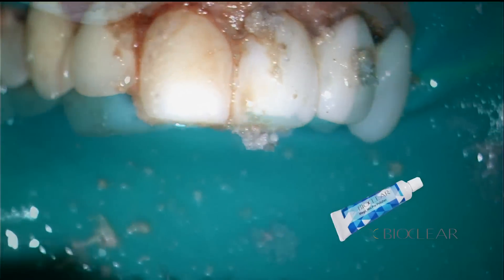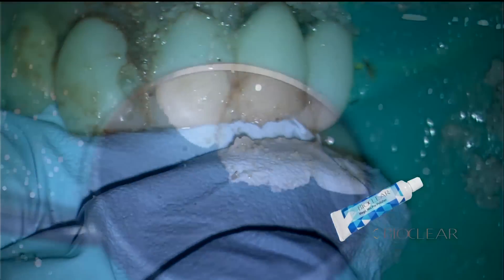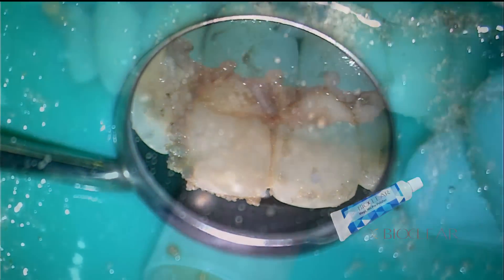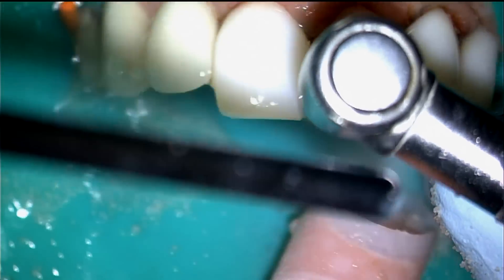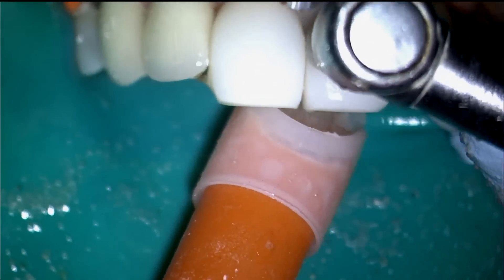The new Magic Mix by BioClear is a dual abrasive pre-polisher that leaves an ideal satin finish. The final step of polishing is the use of the Shape and Shine Diamond Impregnated Cup.